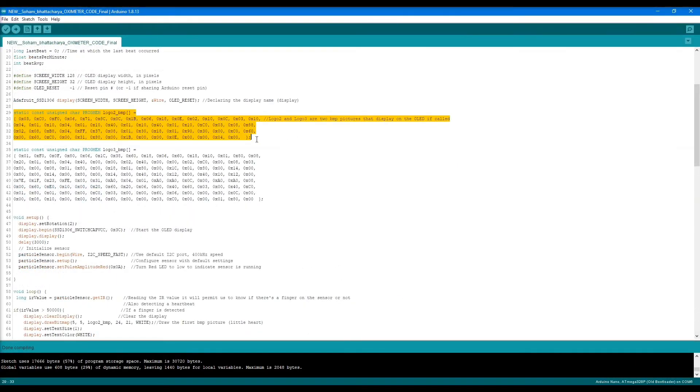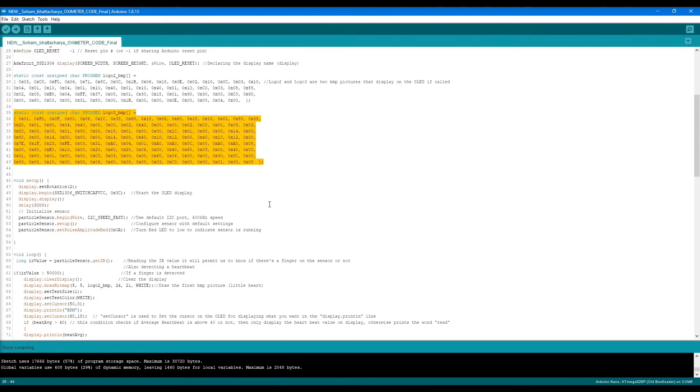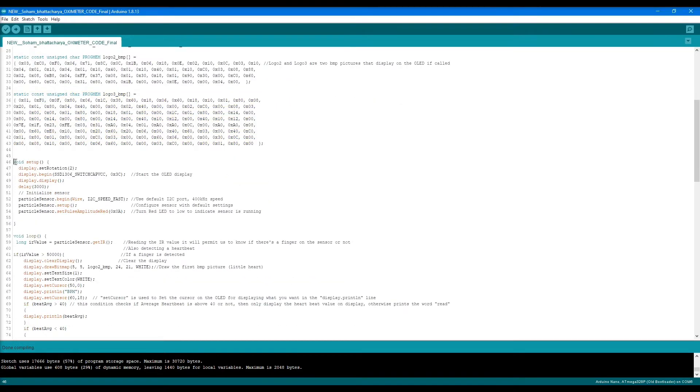From lines 29 to 33 is the smaller heart-shaped bitmap image, and from 35 to 43 is the larger bitmap image of the heart shape. These will be called at a later stage.